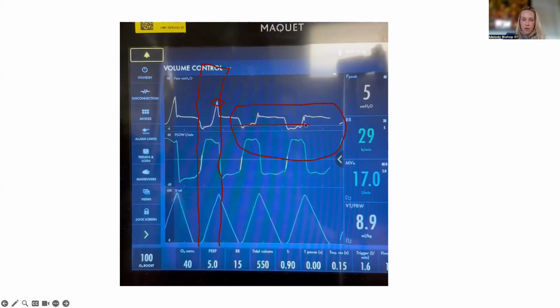Yeah, you hit the nail on the head there. Just to get into the nitty gritty very quickly here, in volume control, we should have a set amount of flow in the circuit. You also have bias flow that moves through, but that means that there is a set amount of flow available. This patient is pulling and exhausting all that flow and probably opening the anti-suffocation valve that every ventilator has and literally pulling extra flow.